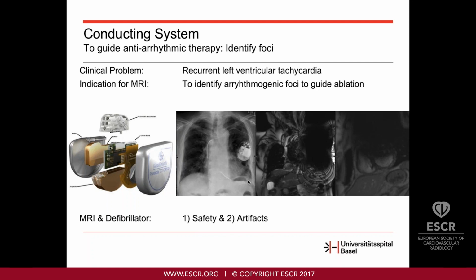And this finding or this description helped our electrophysiologists to plan their treatment, because if they want to treat a scar that is subendocardially, they use a transluminal approach.